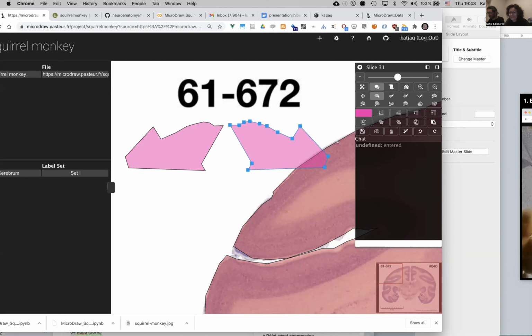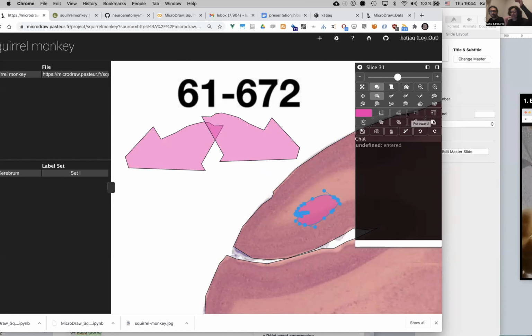So that's quite cool. You can also layer stuff. For example, what I did earlier, imagine that there's another sulcus here and you actually want to subtract that, but you drew the little part for subtraction before. So it would be completely absorbed, I have to do it again. I'll just draw a little region like this. Now it's on top and I can access it. So if I want to see this one, I can, and this one I can. But sometimes they're below, so that wouldn't work. And so you can now layer, as you know it from Inkscape, you can just move the layers up and down so that you have access to everything that you drew at every time.